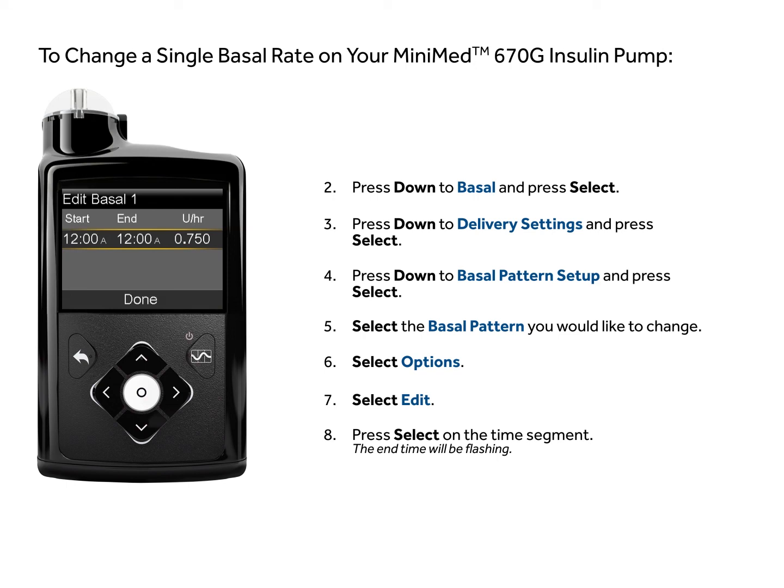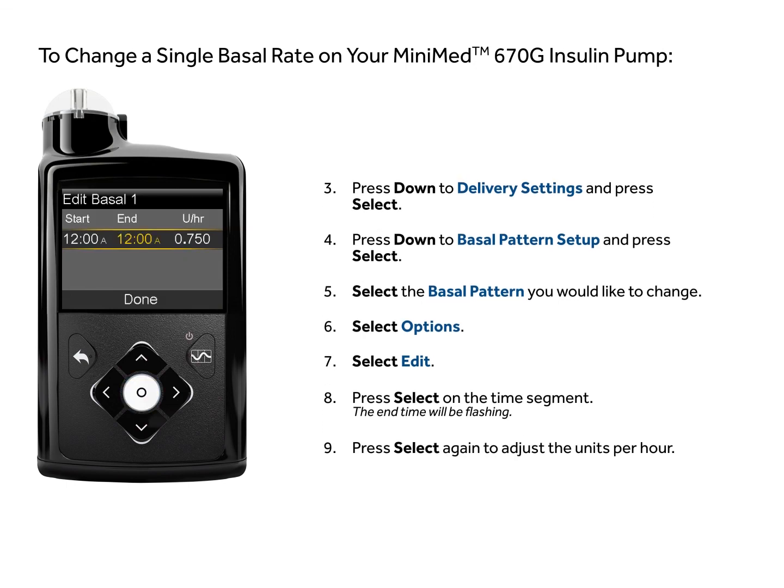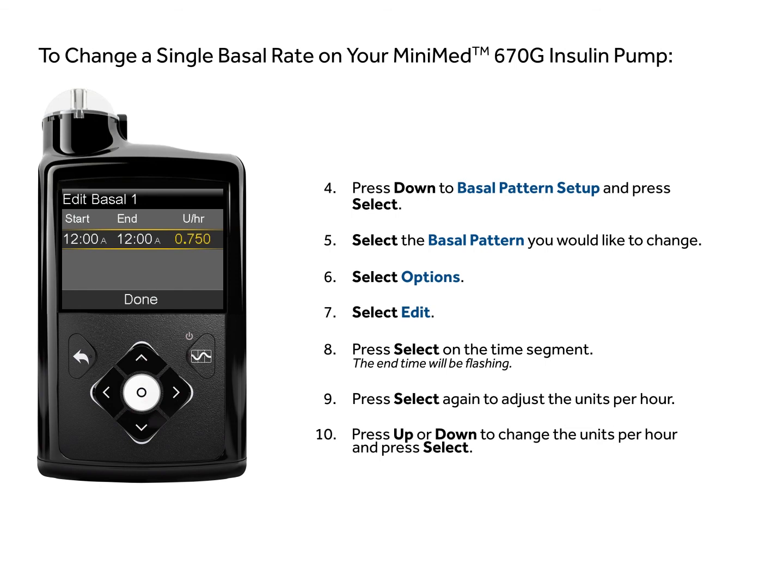The end time will be flashing. Press select again to adjust the units per hour. Press up or down to change the units per hour and press select.